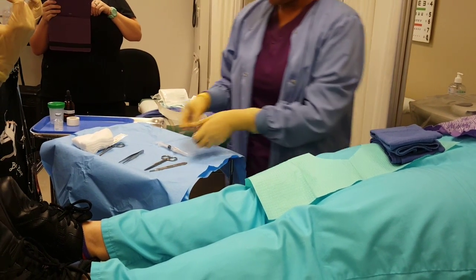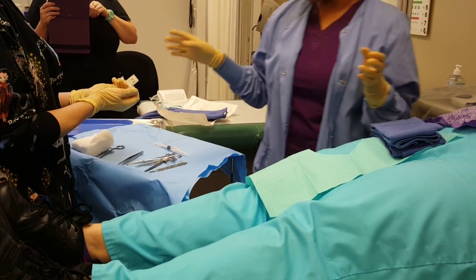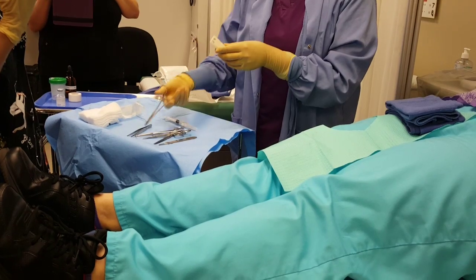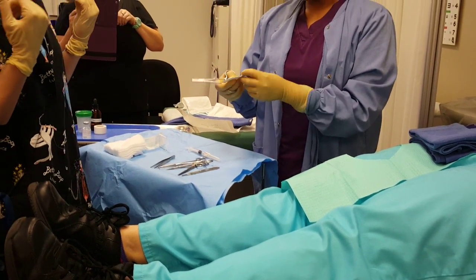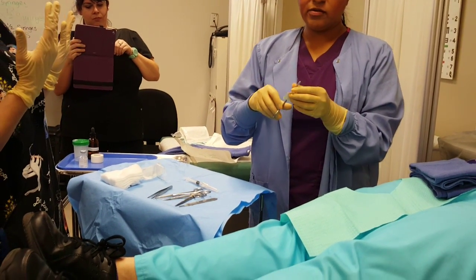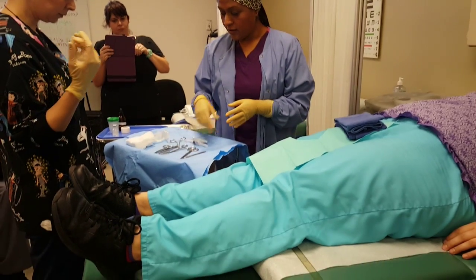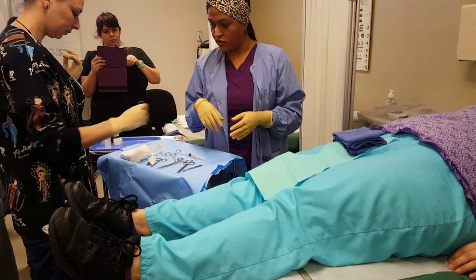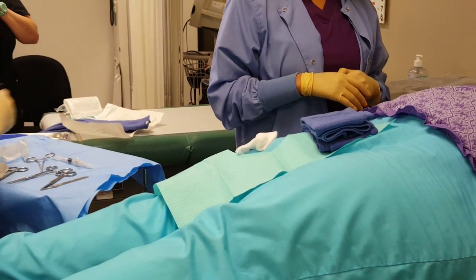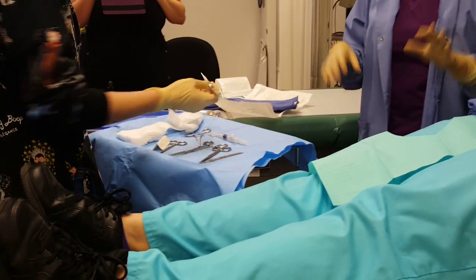The doctor pretends to excise the mole and requests suture material. Doctors typically just throw everything around without regard for how long the MA took to set up the tray. There's usually a specimen container for the removed tissue. Some physicians like the MA to load the needle on the needle holder; others prefer to do it themselves. After suturing and scissors to cut, the doctor instructs Miss Newman to dress the wound and give post-care instructions, then the doctor leaves.